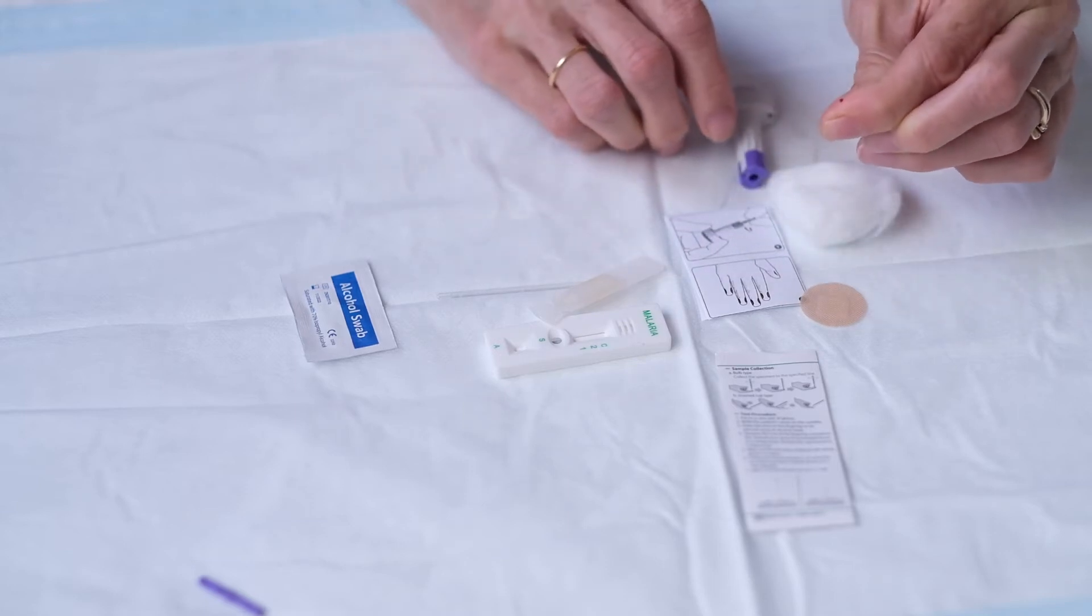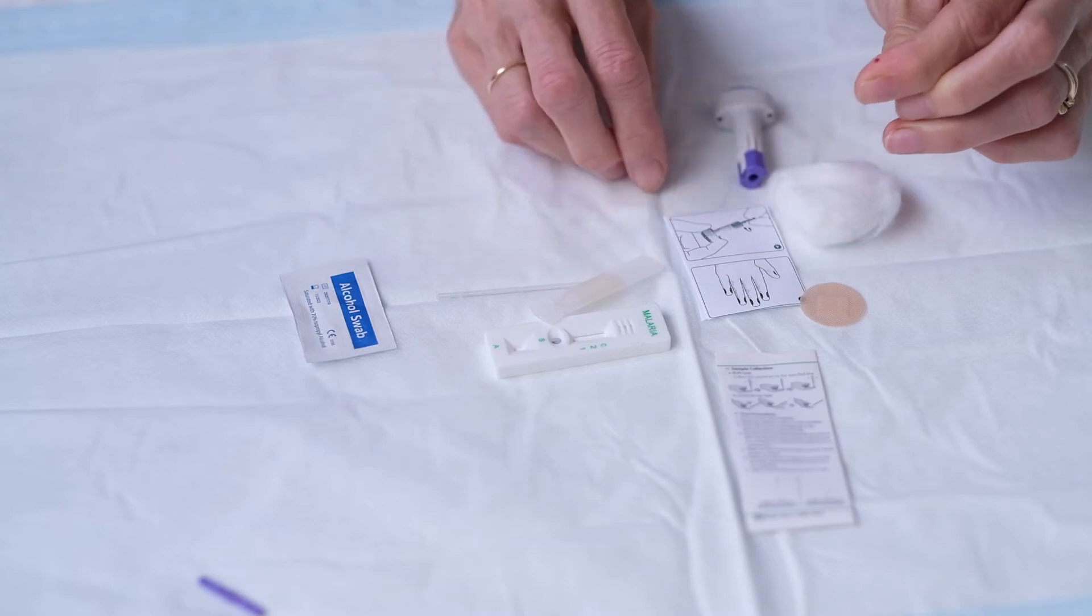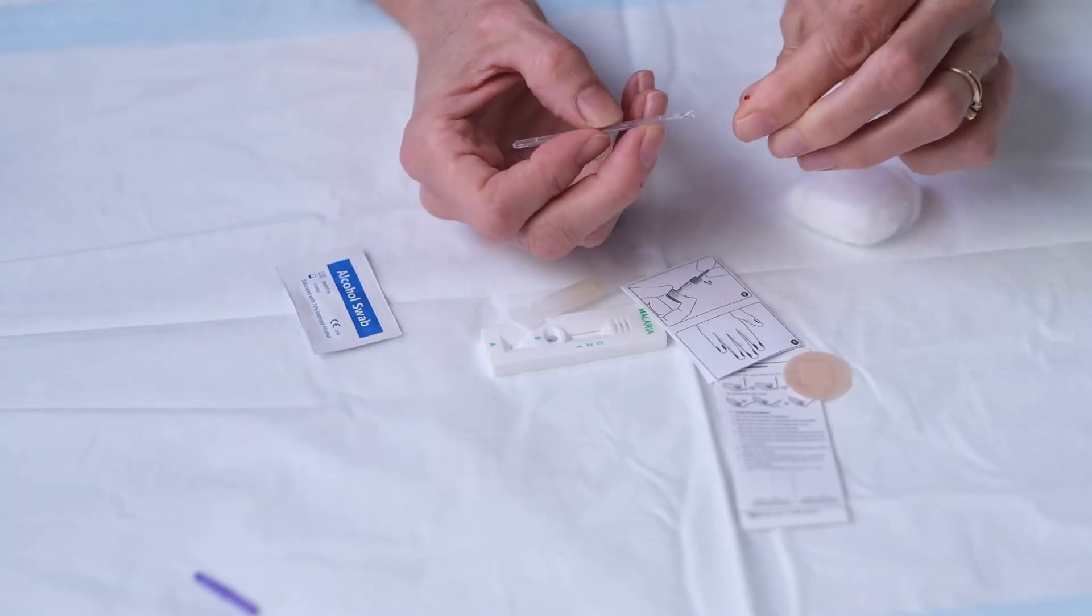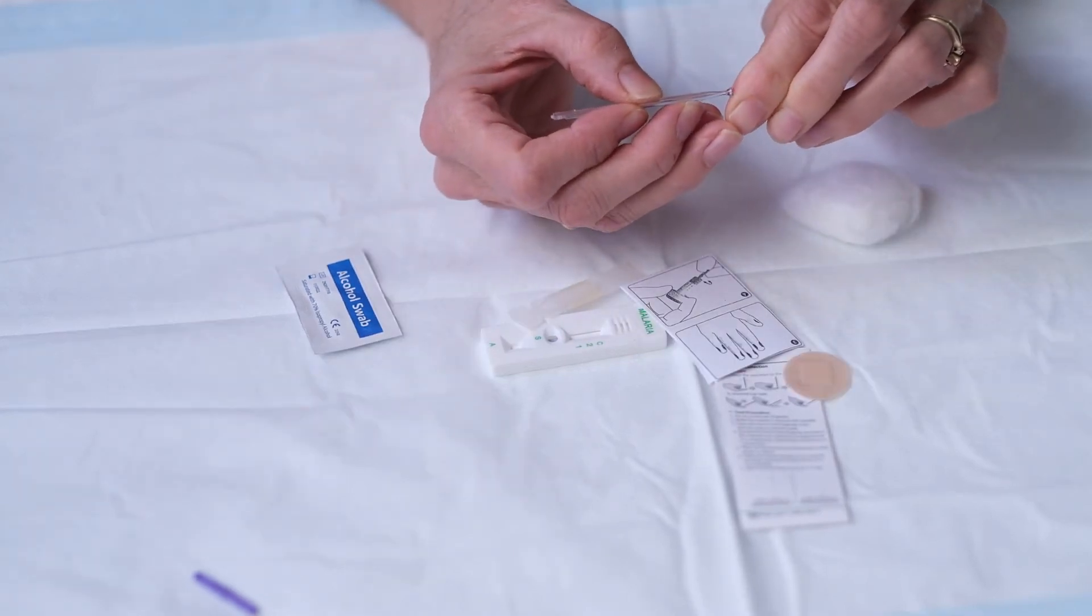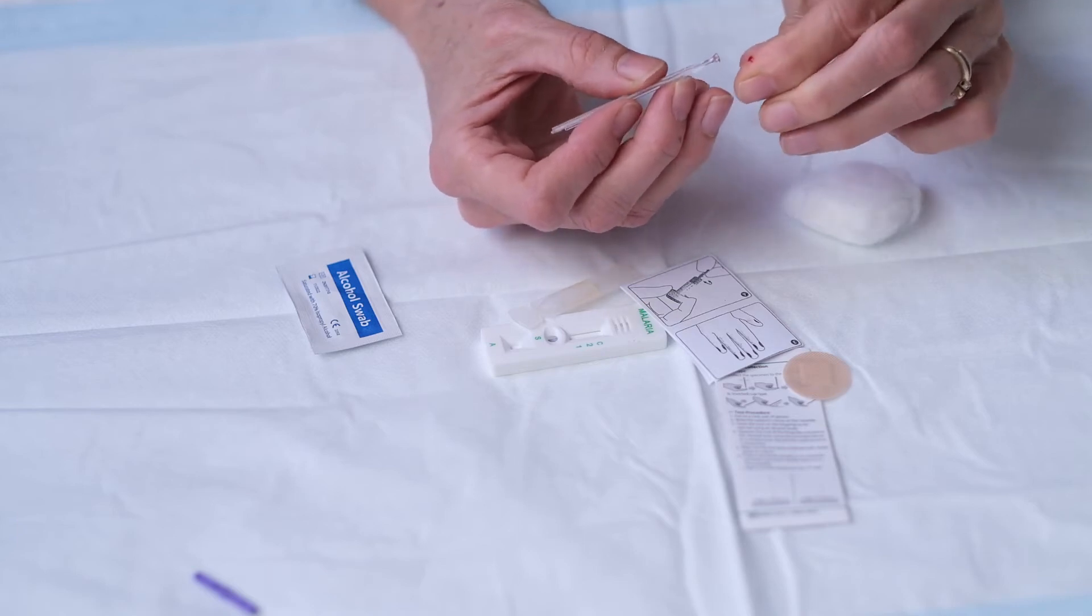Sorry, I'm a big sook. And give your finger a bit of a squeeze. We need to get the blood and put it on the little cup.